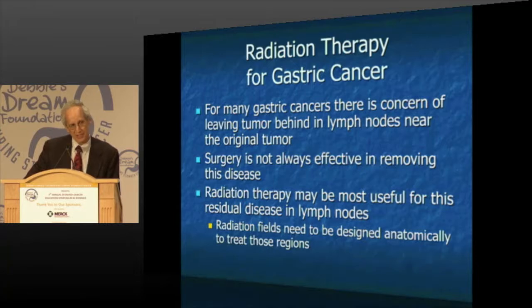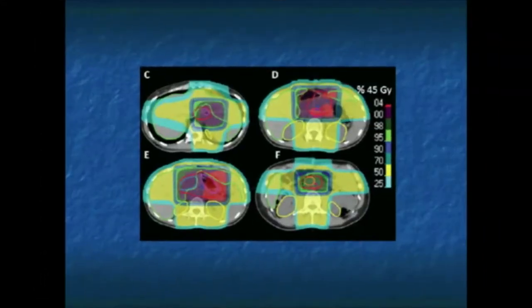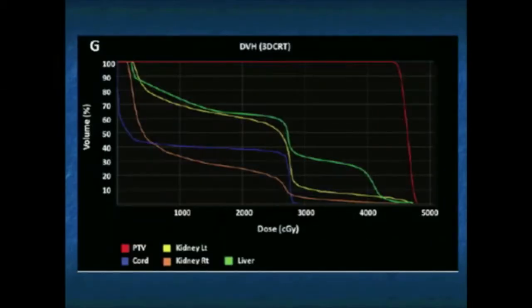So I have a few slides like this. Let me try to explain this to you without a pointer, which is hard. But this is what we call a color wash. These are 4 images of the same patient at different CT scan levels within the body. Some are higher up, some are going down. So you're looking like you cut across the patient and looking at that area. In the back, you see the spine. The areas that are sort of red and blue are where the various radiation beams are converging from different directions on the areas that we wish to treat. And the kidney and the spinal cord are all outlined. This is what we would call 3D conformal radiation therapy, which is very standard, but it is not the most advanced approach that we use nowadays.